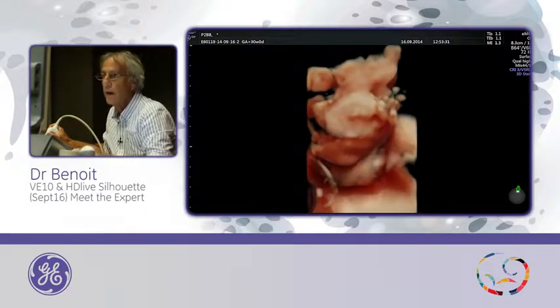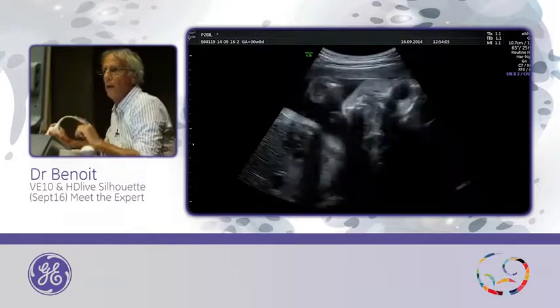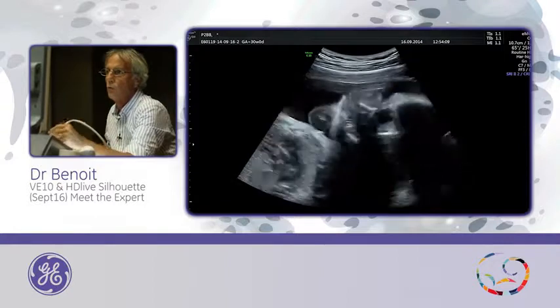And I will switch now to HD Live. And this is a HD Live. We can move the position of the light. I will try to do another one.